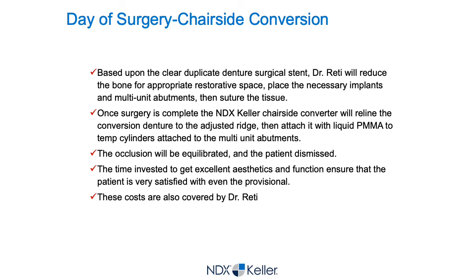Those multi-unit abutments, as a restorative dentist, those are your best friend, because if you think about sometimes how tissue can be hard to work with on a single implant, multiply that by 4 and have angulation issues, it can be very, very difficult to do this kind of restoration to fixture level. So by getting those abutments up to tissue level, it makes all the try-in appointments go much more predictably and, I'd say, easily for you.